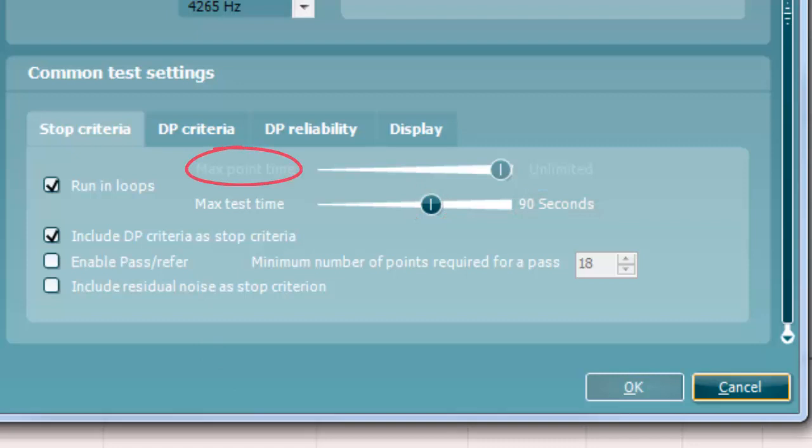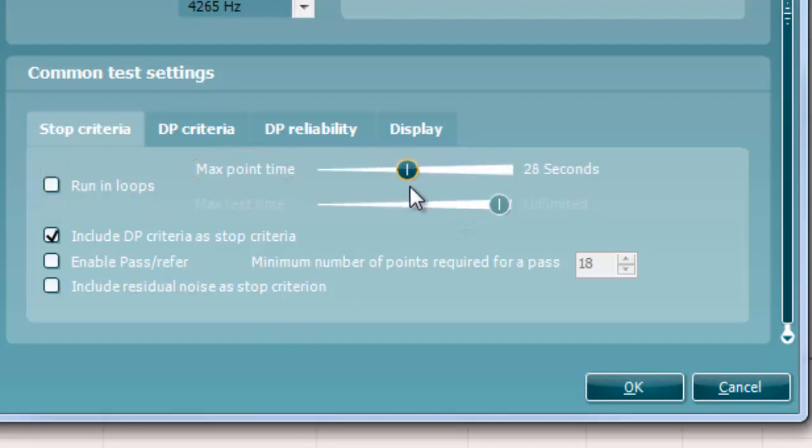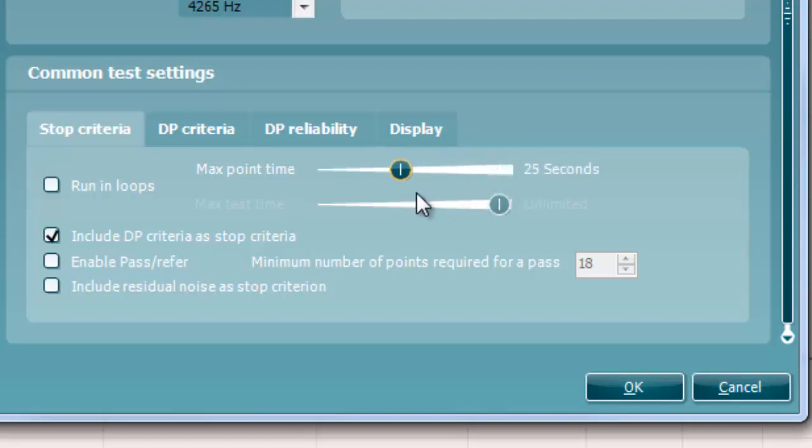A maximum point time can be set when running loops is unchecked. In this instance, each test point will only be tested once for the set point time before it times out, unless it meets the stop criteria prior.